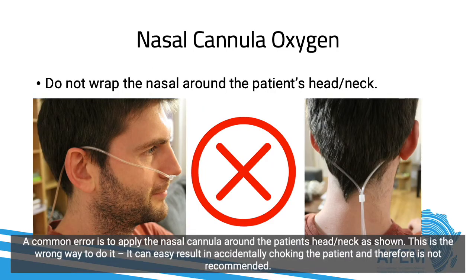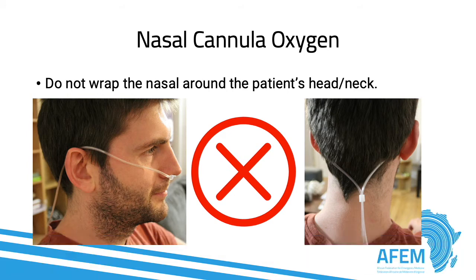A common error is to apply the nasal cannula around the patient's head and neck as shown. This is the wrong way to do it. It can easily result in accidentally choking the patient and is therefore not recommended.